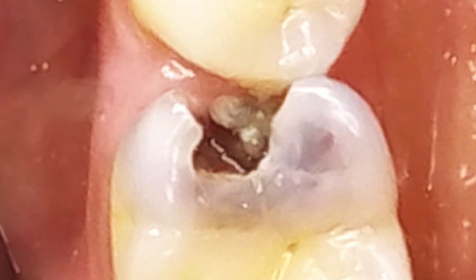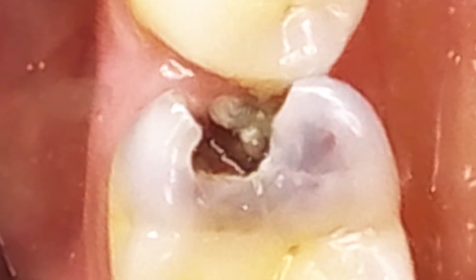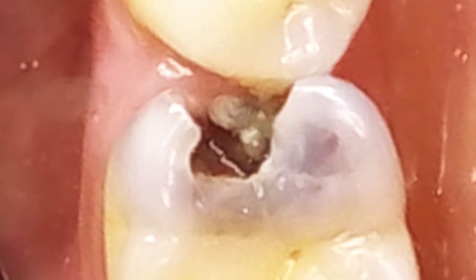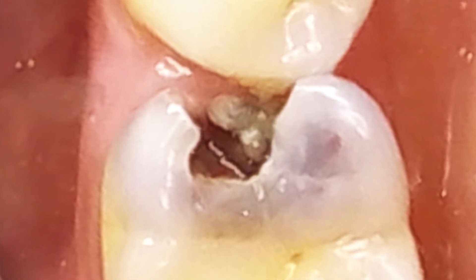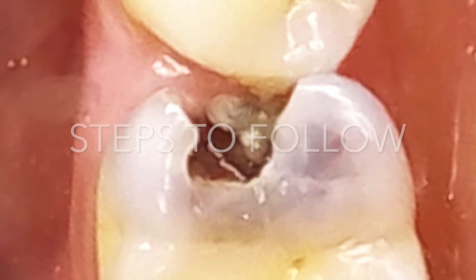Hi and welcome back to the Dental Advisor. Today I'm going to address a crucial aspect of endodontics, which is what steps to follow while treating an endodontically affected class 2 cavity.